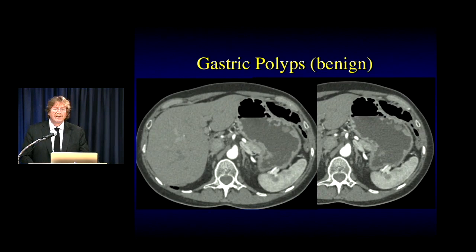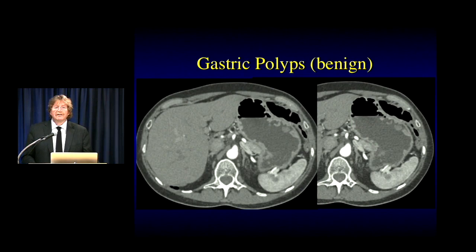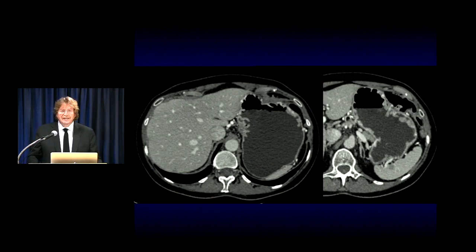Here's that same patient when the stomach is distended. In the prior example, the patient was going for EUS to look at a small pancreatic lesion and we couldn't give water. When the stomach's distended, you can see the patient is lined by polyps — over 100 adenomatous polyps, all benign. Look how easy it is to see the polyps when the stomach is distended; when it's not distended, there's no way to see them.